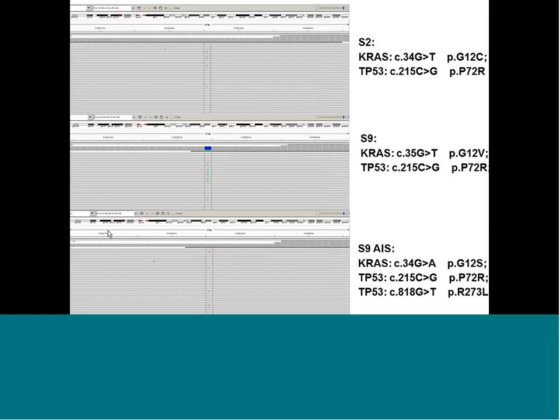So what we did, we analyzed our gene panel and found that every tumor in segment 2 and segment 9, and also a small adenocarcinoma in situ, which was not diagnosed previously, had its individual molecular signature. So we had actually a patient with 3 different very small tumors, and all were surgically removed, because this patient is now not a T4 stage patient, but a T1A with 2 tumors, multiple tumors.